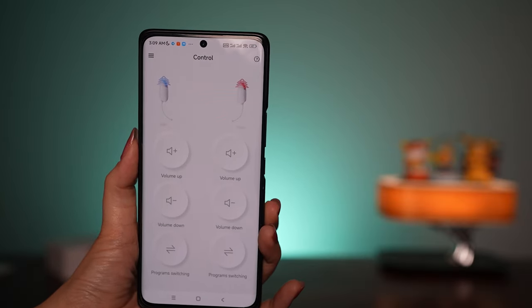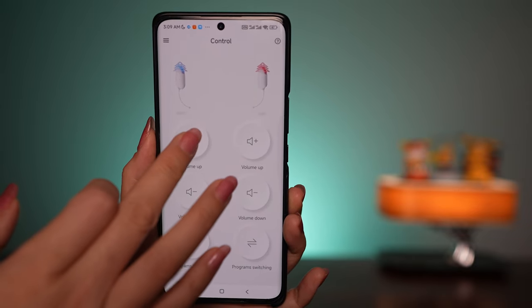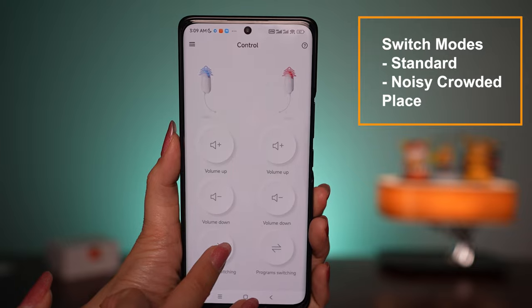You can access the app to make some adjustments — let me show you. Inside the app, you can control the volume: you can increase and decrease it, and every time you change the volume you'll hear a sound. You can also switch the program from standard to restaurant mode.